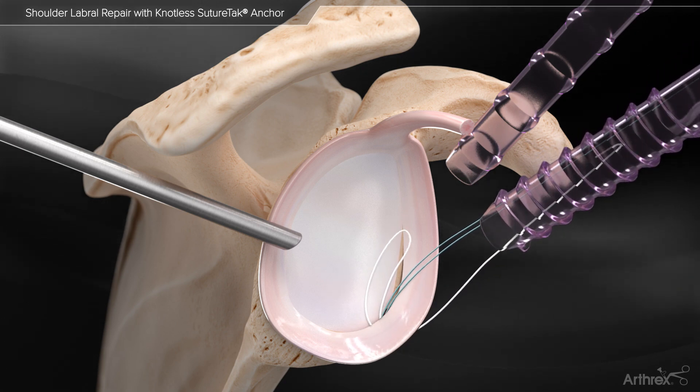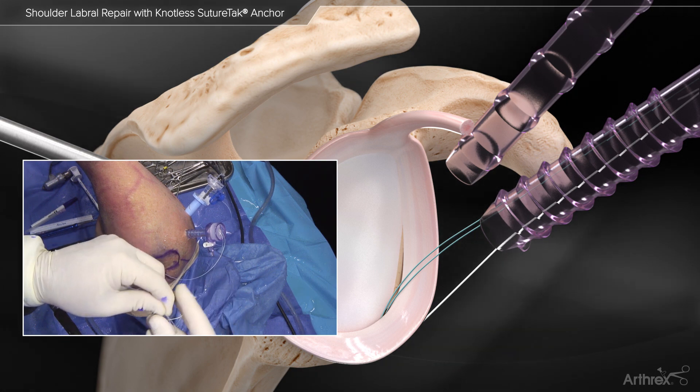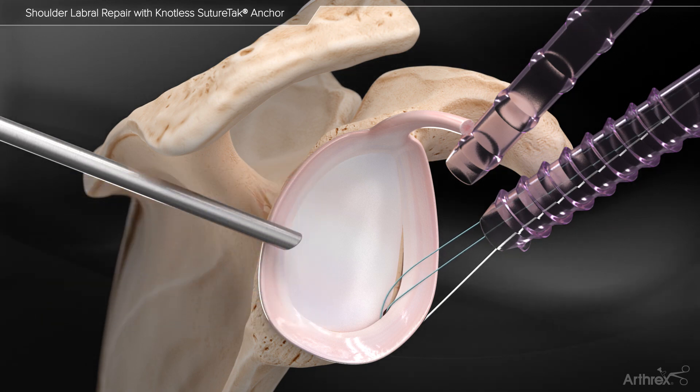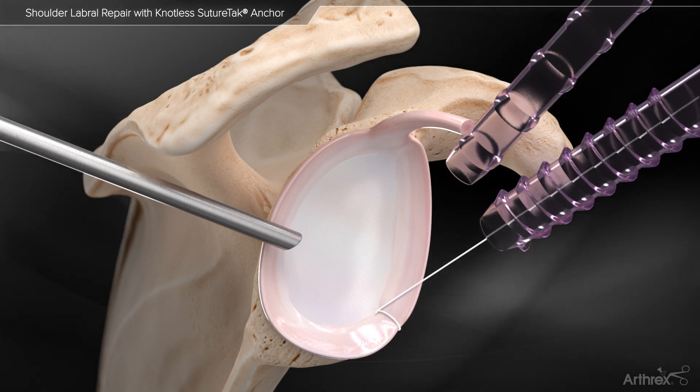The suture splice locking mechanism is created by inserting the repair suture into the loop of the Fiberlink shuttling suture. The other end of the Fiberlink shuttling suture is pulled, shuttling the repair suture back into the anchor, completing the splice.